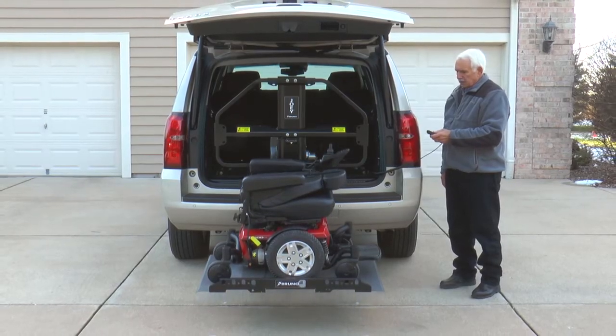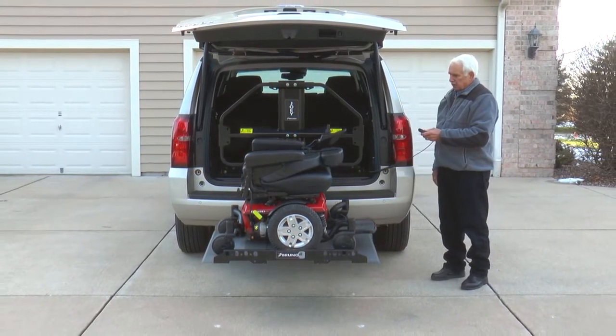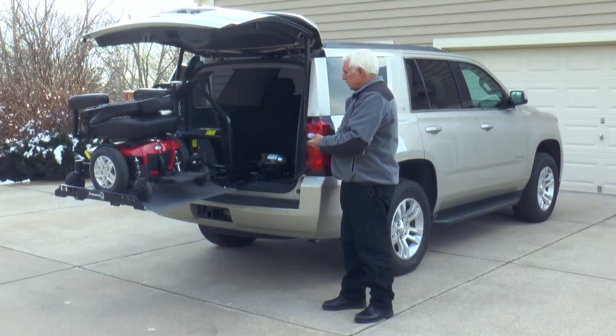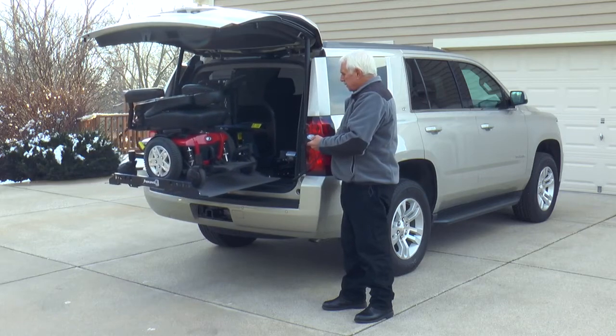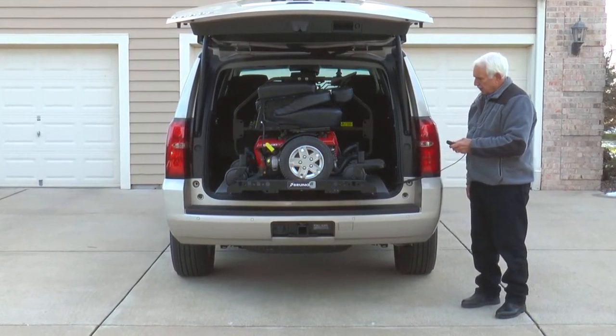The Joey's industry exclusive safety barrier ensures the mobility device stays secured and unable to enter the passenger area, even during sudden stops. Because the safety barrier eliminates the need for securement belts in most vehicles, the Joey is the fastest and easiest interior platform lift on the market.